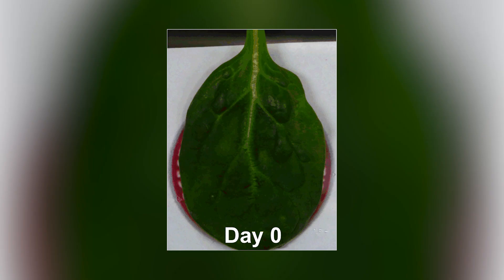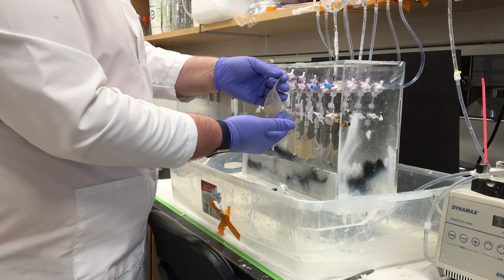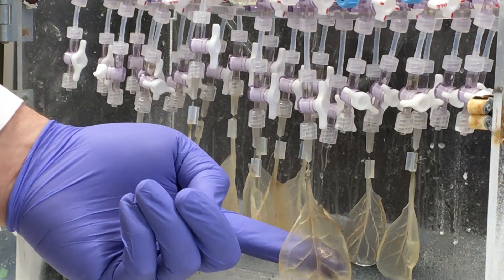We take spinach leaves and perfuse them with a detergent that removes all the cellular material from the spinach leaf. What we're left with is the structure that keeps those cells in place, and then we can seed human cells on that structure. The idea is we have this very thin flat piece of tissue that already has a vascular network, so we can potentially stack up multiple leaves and create a piece of cardiac tissue.